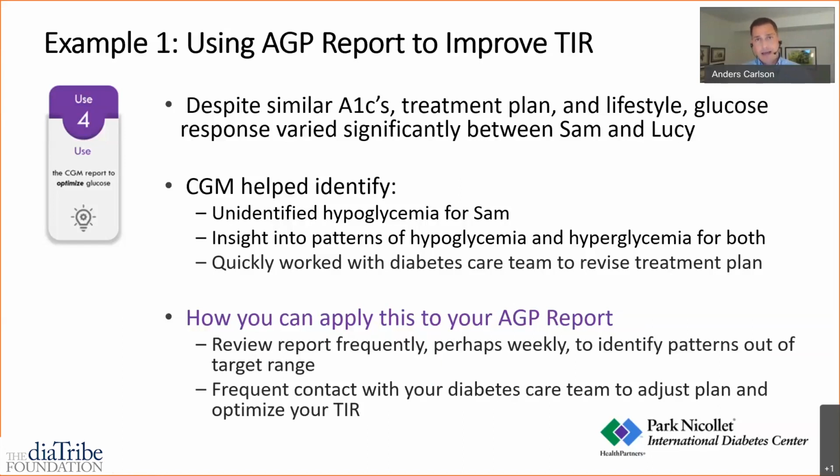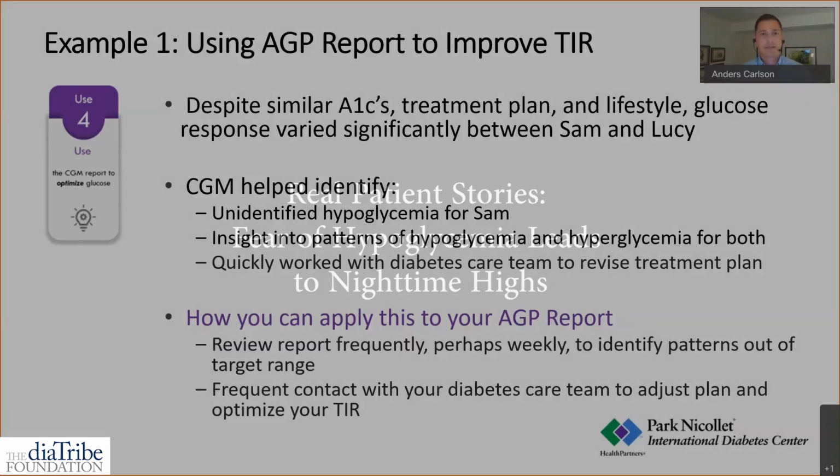And on the flip side of that, what you learn from your patterns, if you notice, I saw this on my CGM, I made this change to my insulin dosing or to my exercise, those sort of diabetes hacks are really useful to us to relay to other patients. That's how we learn as well. So, when you learn something about yourself, please let your diabetes team know, because that's how we learn and that's how we help our other patients live with diabetes.